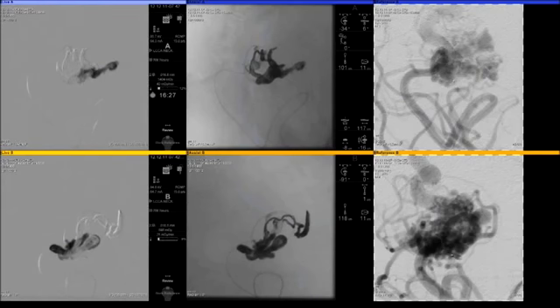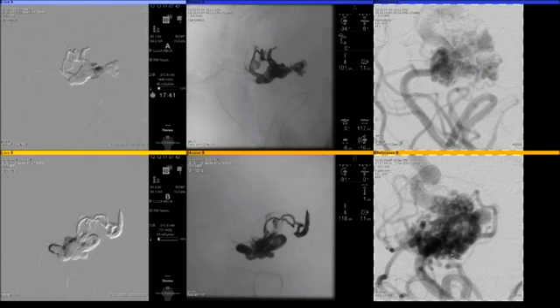And the key aspect of that is to know when to stop, so the continuous observation of the AP and lateral planes. I do choose, as you can see on the right side as the model, the kind of mid-nidus view, so that you don't get too much of artery or too much of vein. You're basically looking to the size of the nidus as much as possible as a model, so then you can gradually start to sculpt this nidus using the Onyx.